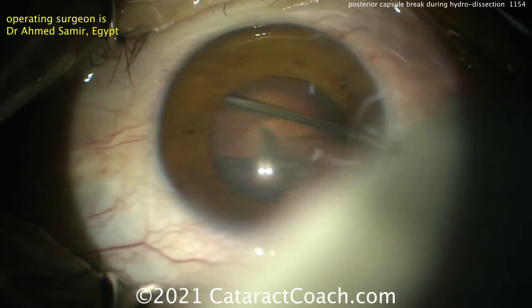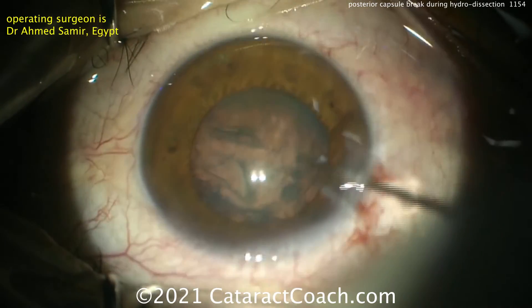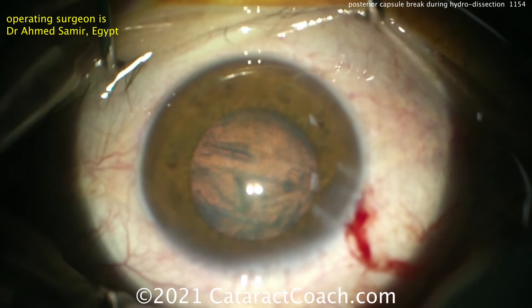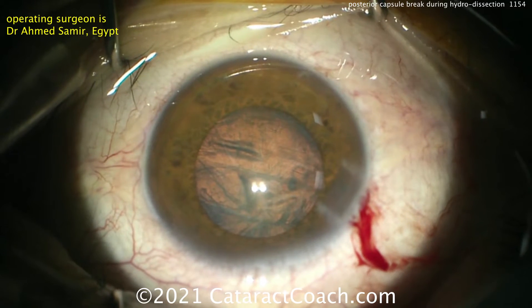So watch carefully. He'll do some hydrodissection and the capsule's already blown out just like that. Now this can happen to anyone. You can see those horizontal lines there. He's probably aware of this too, so he's getting that focus just right.